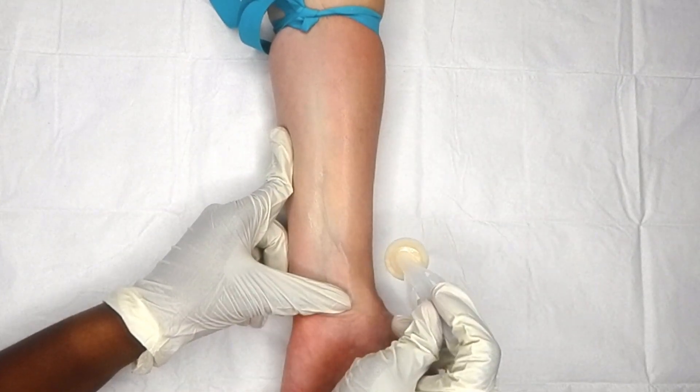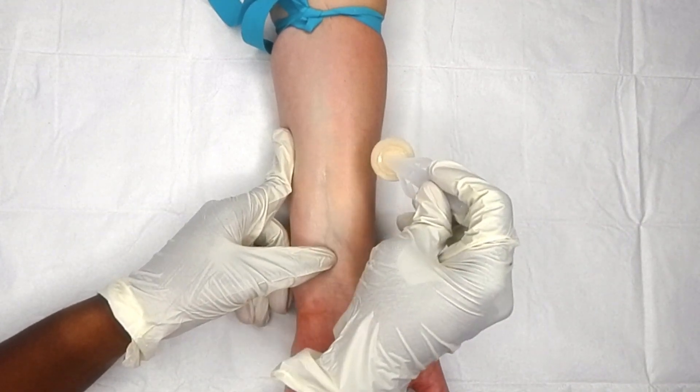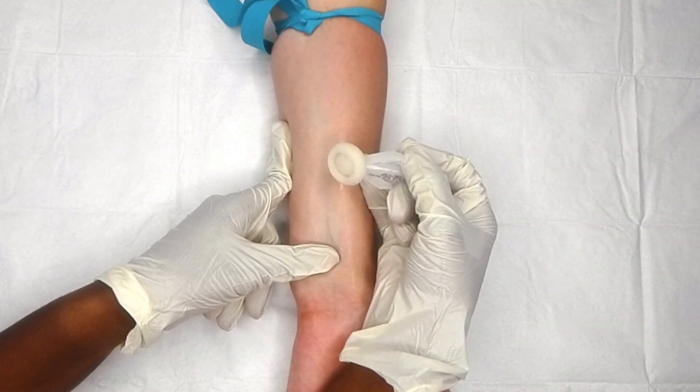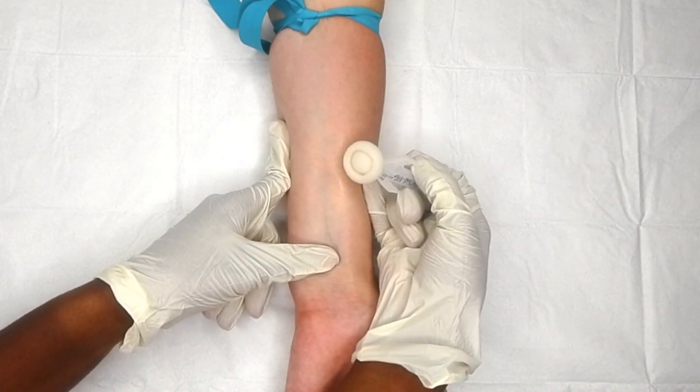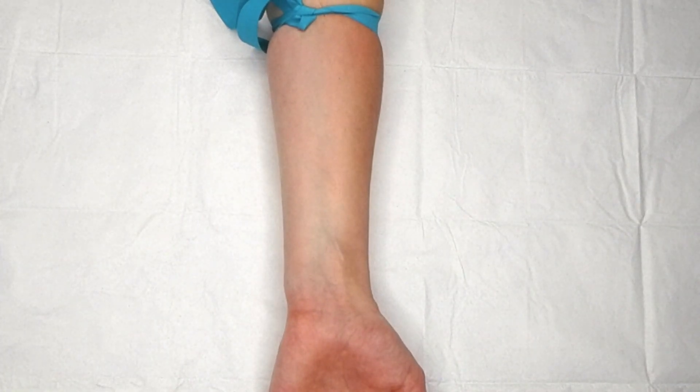While cleansing the site, a few things are actually happening. Number one, obviously I'm cleaning off most of the bacteria. But number two, the constant motion of wiping on that particular vein will help promote venous distension. I know it's common practice for a lot of people to slap that vein to bring it to the surface, but I found that's not even necessary — gently rubbing it with the chlorhexidine wipe will have the same effect.